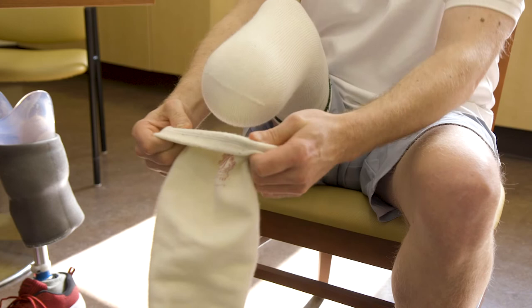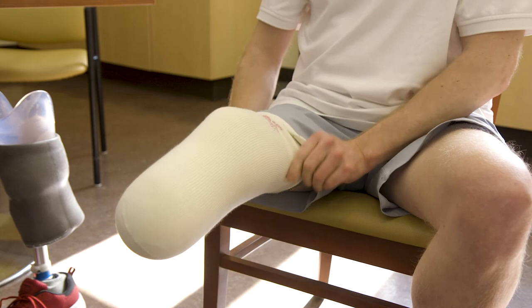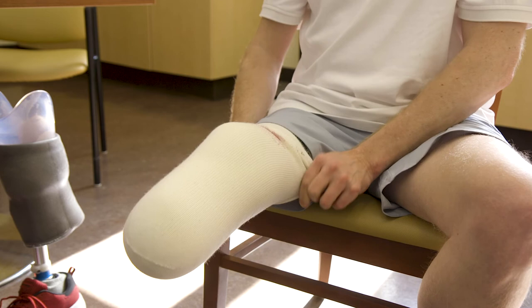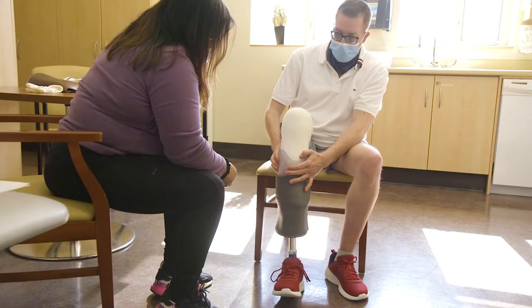If your prosthesis is too loose, you may feel like your residual limb moves within the socket. This can lead to pain under your kneecap and at the bottom of your residual limb because it is sitting too far down in the prosthesis. You will need to add more socks to get a better fit. Start by adding one single layer and increase as needed.